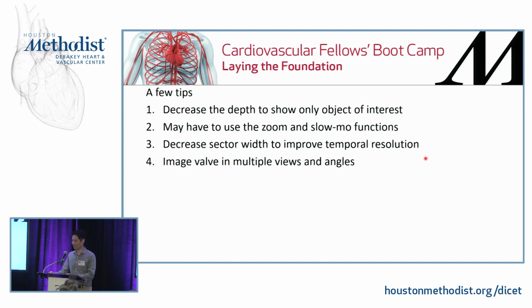Decrease your sector width, like I said before, sometimes that helps. The only thing with that is that your object of interest has to be right below, right in front. If it's off to the side, then it's going to be difficult to see it with decreased sector width.